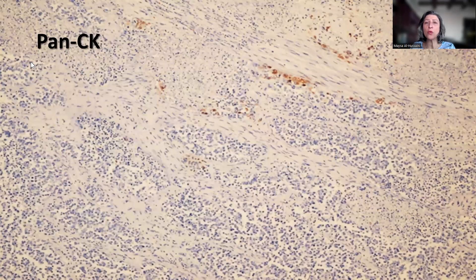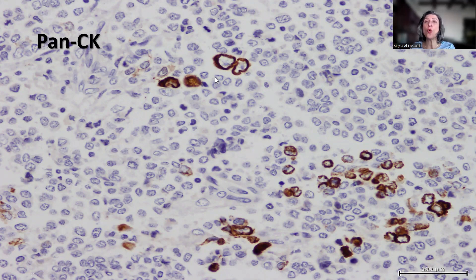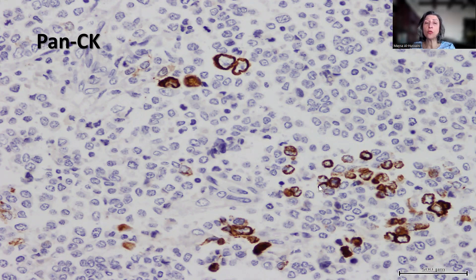With cytokeratin, there is a very peculiar pattern of expression. Most of the tumor is completely negative, but only focal staining in some of the tumor cells — smaller groups of tumor cells — but these groups show strong pancytokeratin positivity. Regardless of which pancytokeratin you use — whether MNF, AE1/AE3, or CAM5.2 — they tend to show almost the same feature: most tumor cells are completely negative; however, there are small groups and pockets of strongly positive tumor cells. This should be an excellent clue to the possibility that this represents undifferentiated endometrial carcinoma.